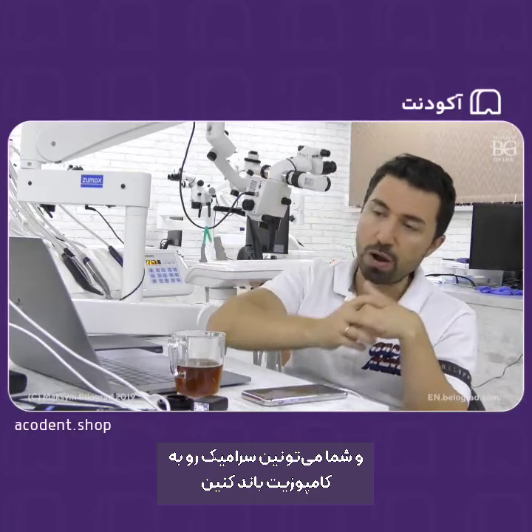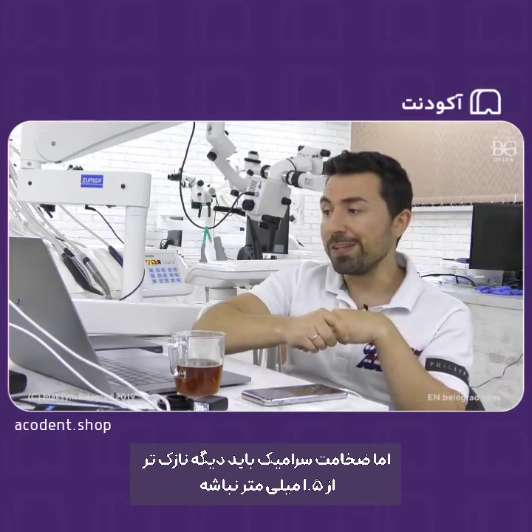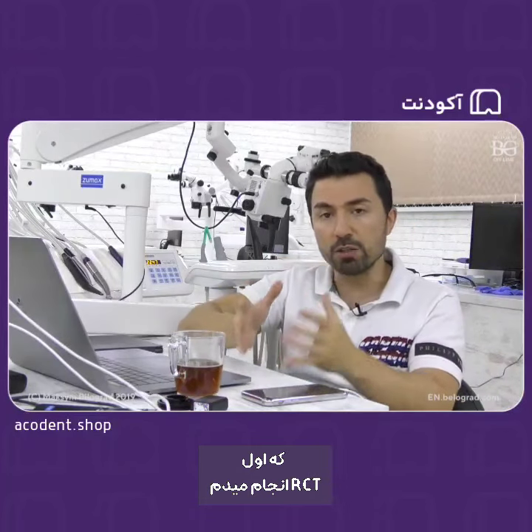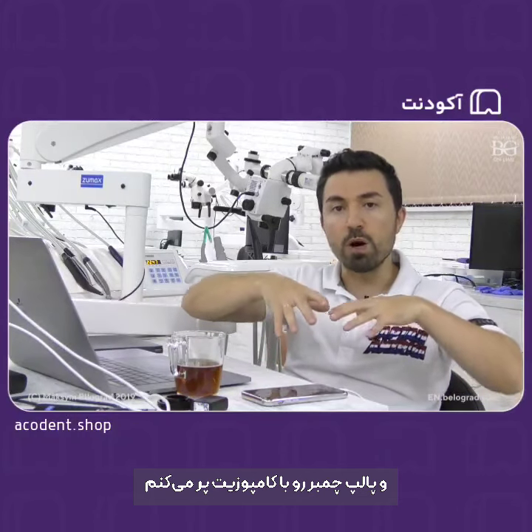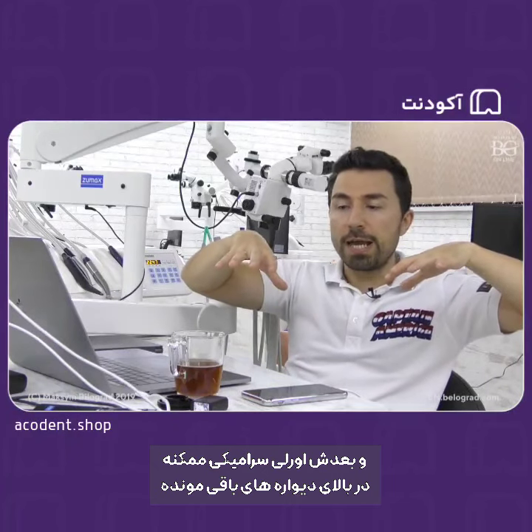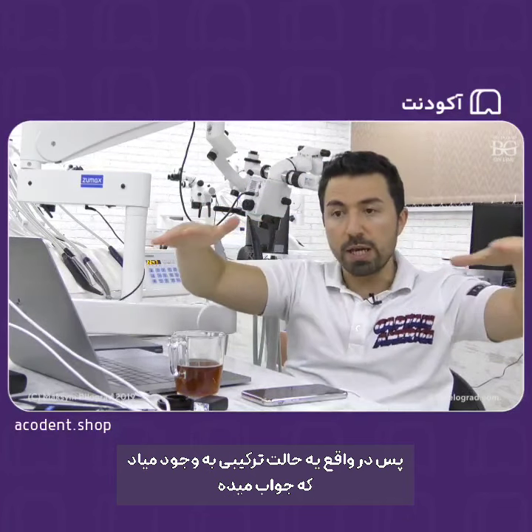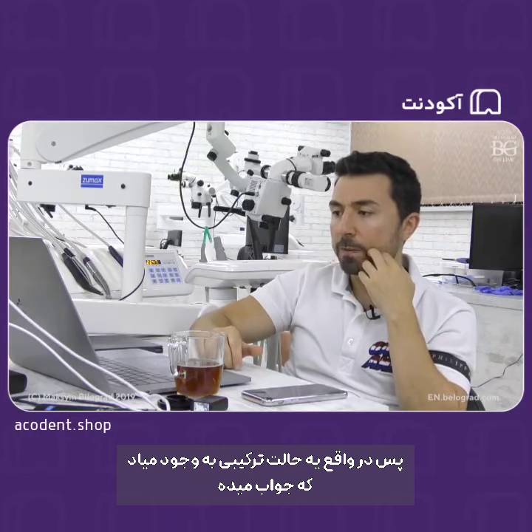You can bond your ceramic over composite, but the thickness of ceramic has to be not thinner than 1.5 millimeters. So basically when you do endodontic treatment, this is my approach. I do an endodontic treatment, then I do build up. I fill the pulp chamber with composite, and then I spread my composite filling also over the walls, and then the ceramic overlay may go over the top of the remaining walls and also on the composite that is inside the tooth. So basically there will be a combination. It works.